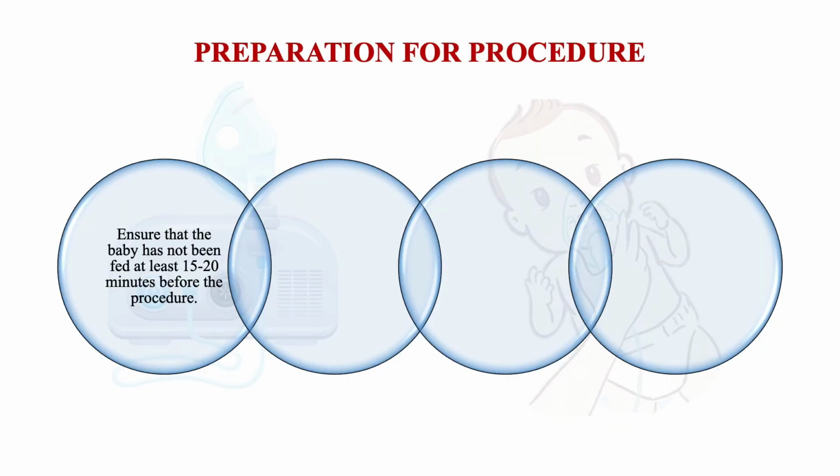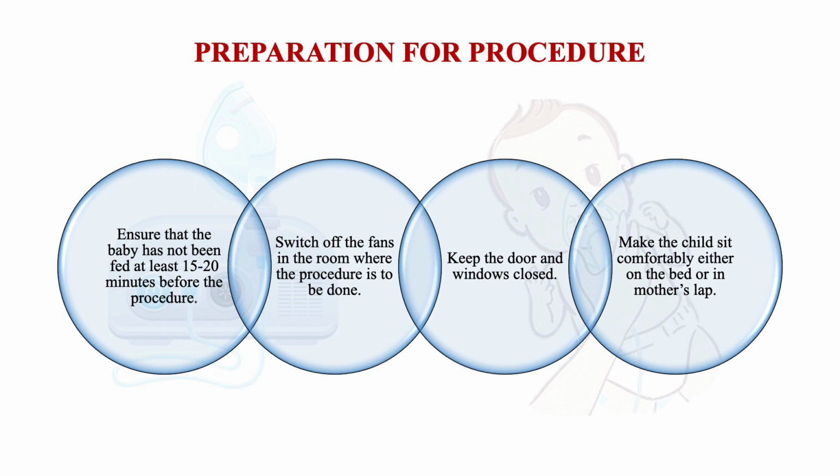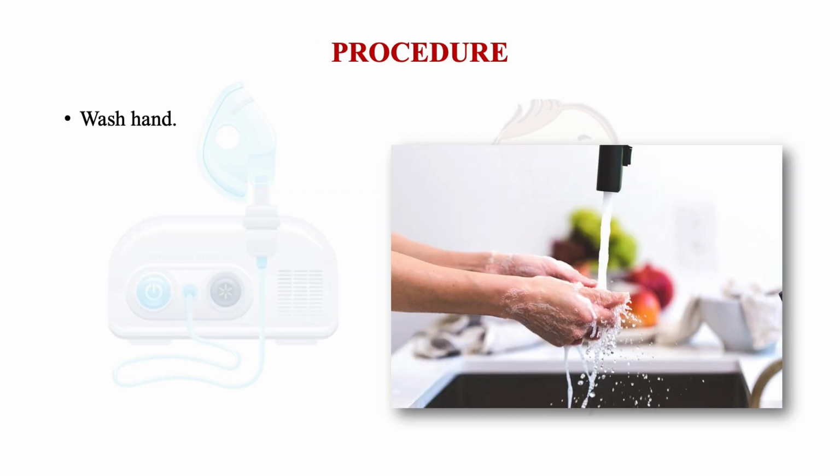Preparation for the procedure. Ensure that the baby has not been fed at least 15 to 20 minutes before the procedure. Switch off the fans in the room where the procedure is to be done. Keep the doors and windows closed. Make the child sit comfortably either on the bed or in the mother's lap. The procedure can be started by washing hands.